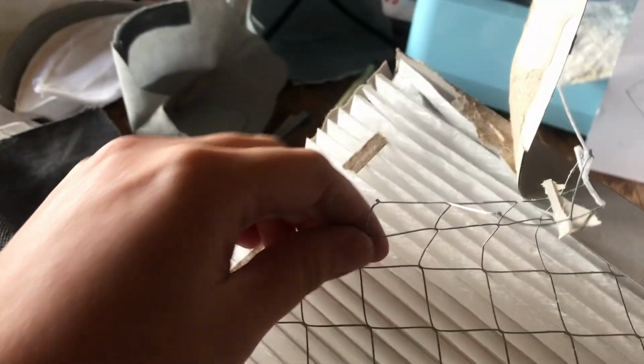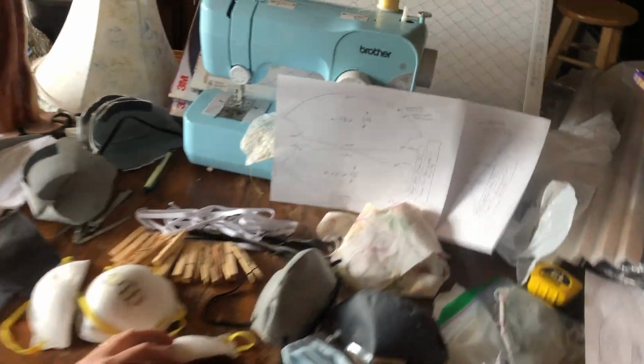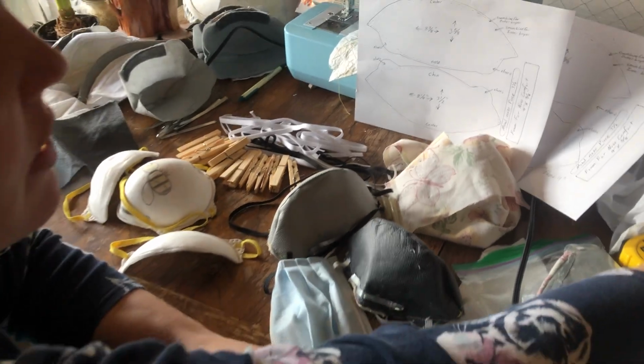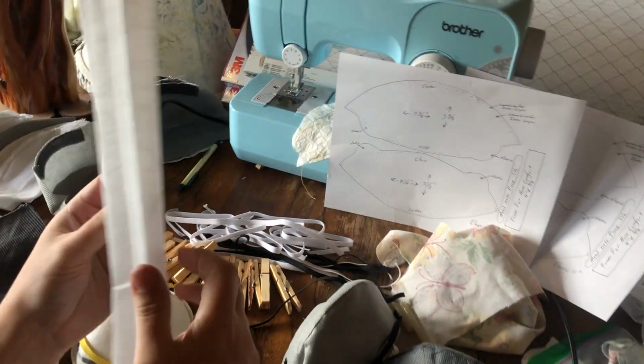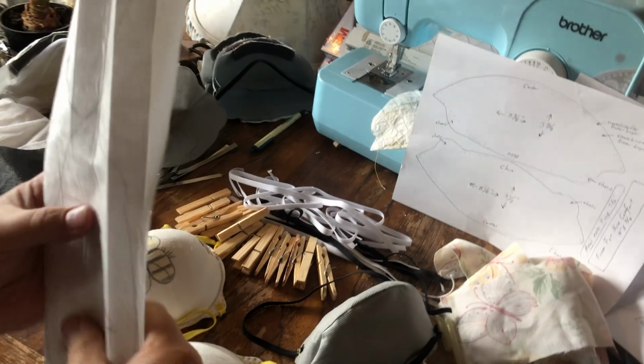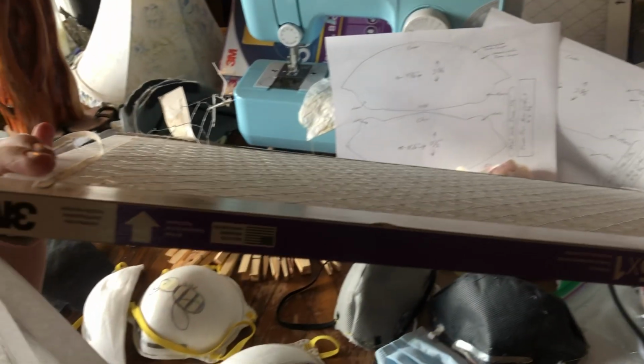For now, this stuff comes off and this stuff unravels, and you've got yourself quite a nice little chunk of filter fabric. And then I got thinking, well, this stuff is pretty lightweight. So I cut the pieces. I think you're better off if we double this. Airflow. So I've got the airflow on the filter. And when you buy your filter, Ace Hardware actually donated all these other ones to me after I figured out what I was doing.